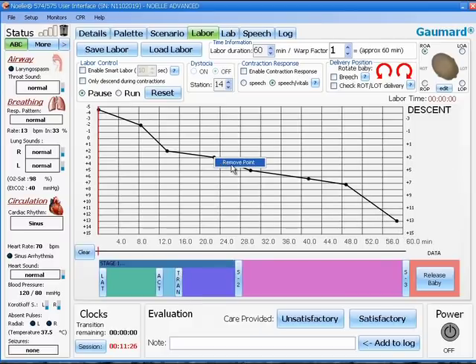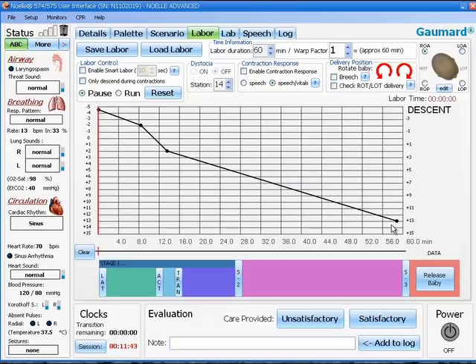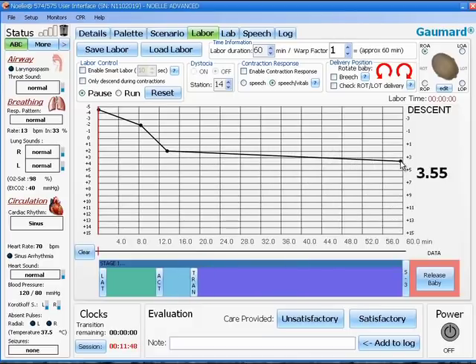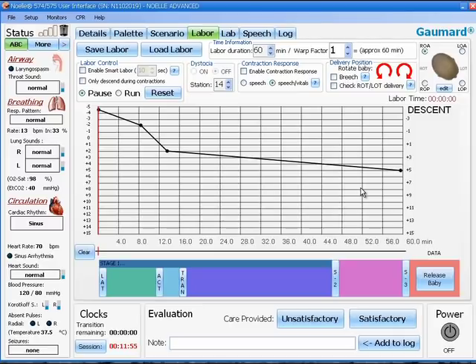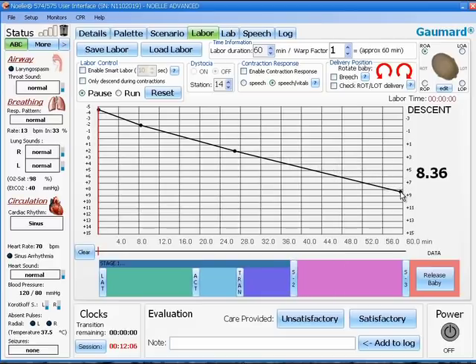If you right click on a point, you can remove that point. If your final point on the right hand side is above station 4, when the delivery motor gets to the end of the cycle, the software will ask you if you wish to deliver the baby or not. If that point is below station 4, when the delivery motor reaches the end of the cycle, it will continue to deliver the baby anyway. The numbers on the bottom of the graph represent the time in minutes of your labor scenario.